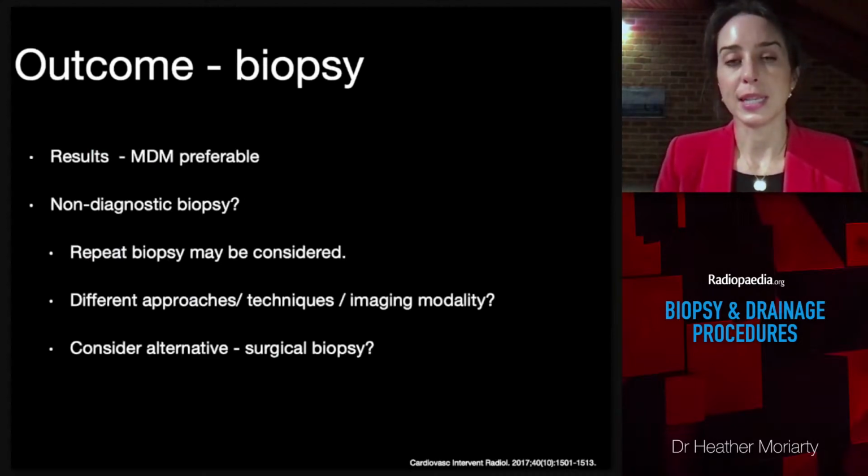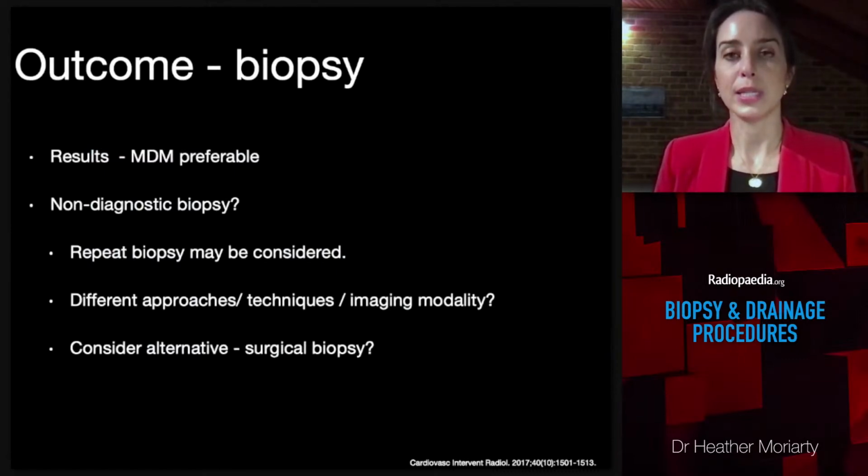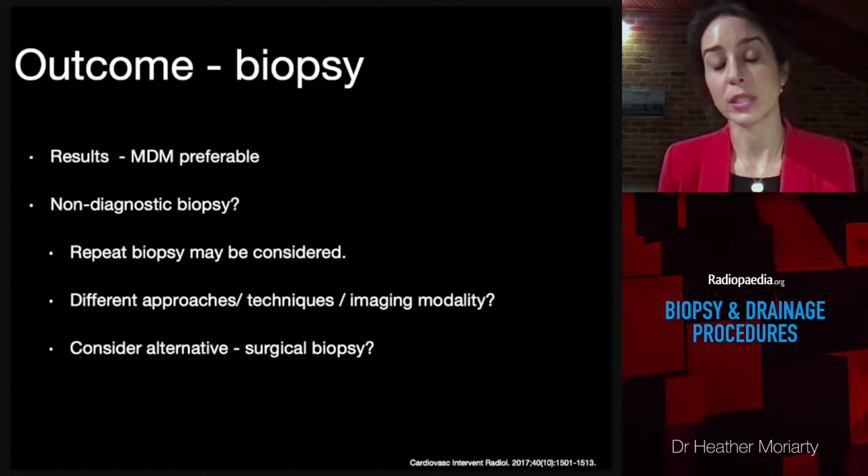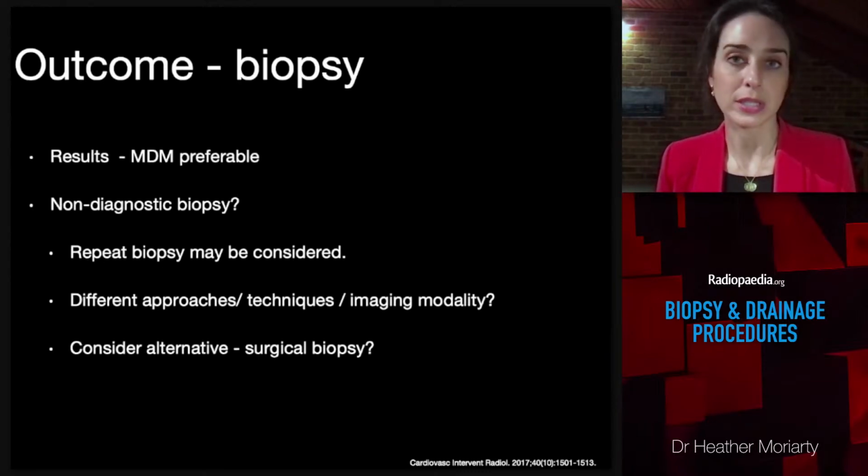Results of a percutaneous needle biopsy should be evaluated and discussed by an MDM team when necessary. When biopsy results are non-diagnostic or discordant to what is clinically suspected, a repeat biopsy should be considered, also considering different approaches or techniques, including surgical options.